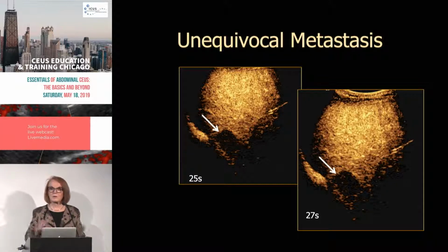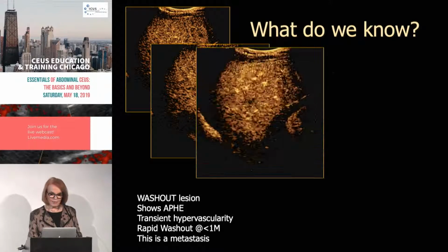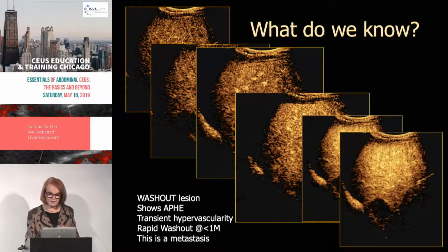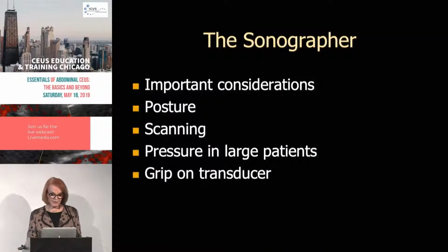My medical oncologist will stand right up at a meeting and say, Stephanie solves countless problems for us that used to delay our initiation of the treatment plan until they resolved whether the patient did or did not have a met. These lesions are often indeterminate on CT and MR, whereas we can resolve them. So this is one thing that happens. And we know, because those bubbles come in, that it is a metastasis. So ultrasound for problem solving in the patient at risk for metastases is really terrific to resolve those things.